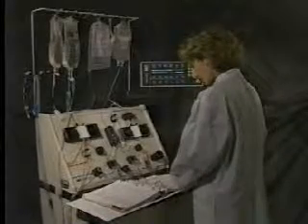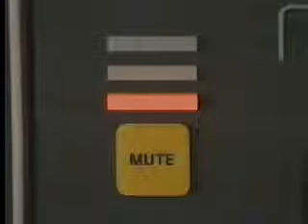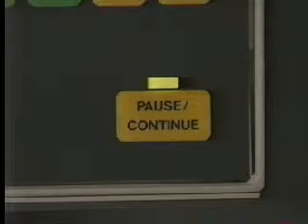Since system shutdown alarms require your immediate attention, they are indicated by a distinctive chime alarm, a flashing red alarm LED, and a flashing alarm message. Since shutdown alarms stop the pumps, the pause LED is also on to indicate that the system is paused. When the pause LED is on steady, the alarm is still active. When the pause LED is flashing, the alarm condition has been cleared.